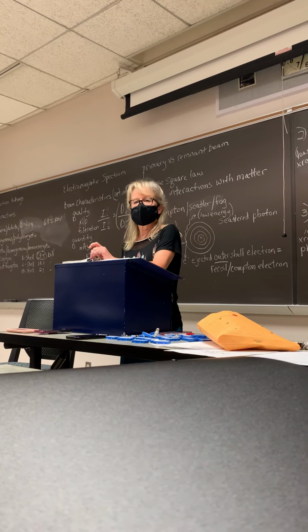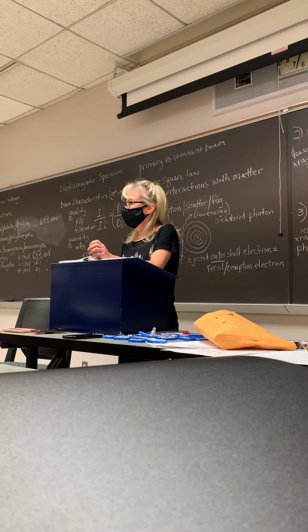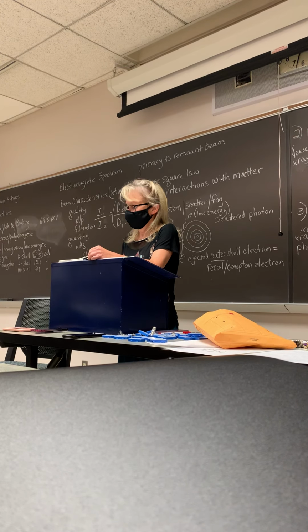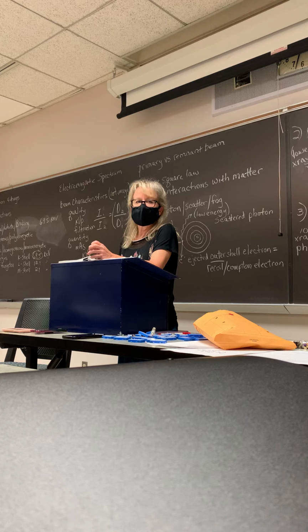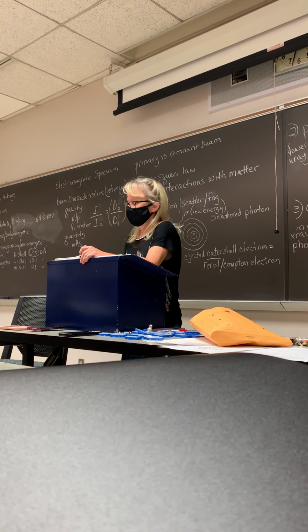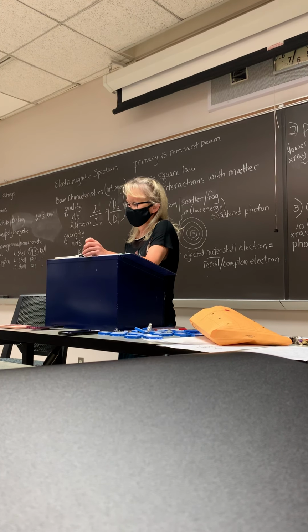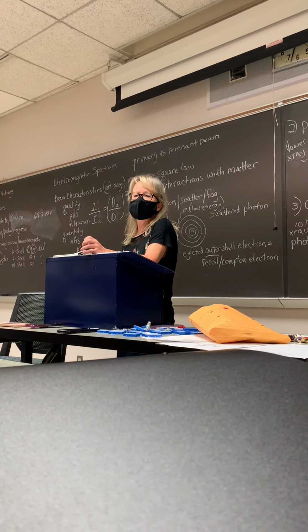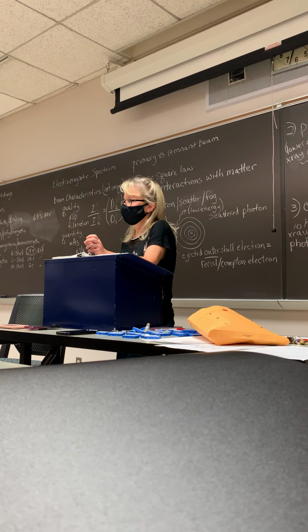Primary versus remnant beam is the next thing, number 3. The primary beam is considered the useful beam. That's what comes out of the tube and hits the patient. The remnant beam is known as the exit beam. Just think of it as what remains as it exits the patient.